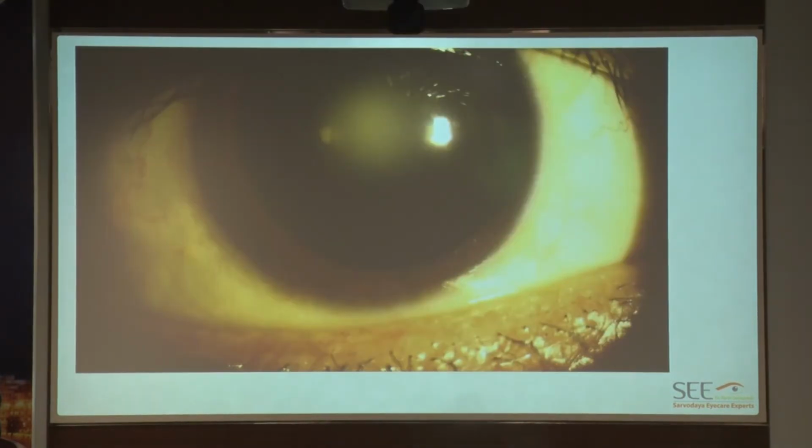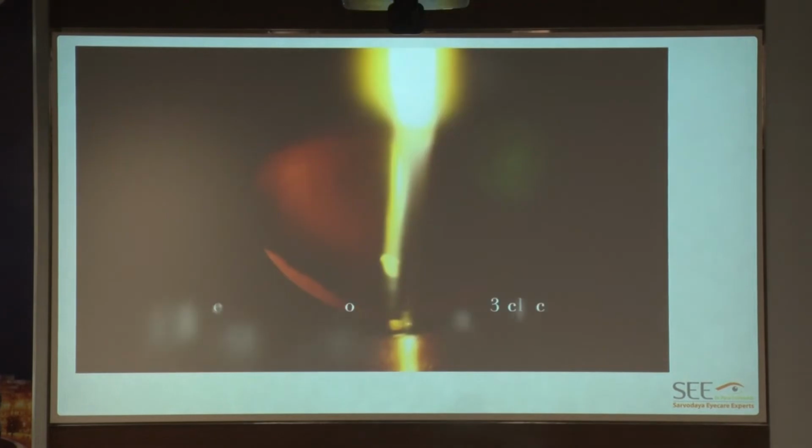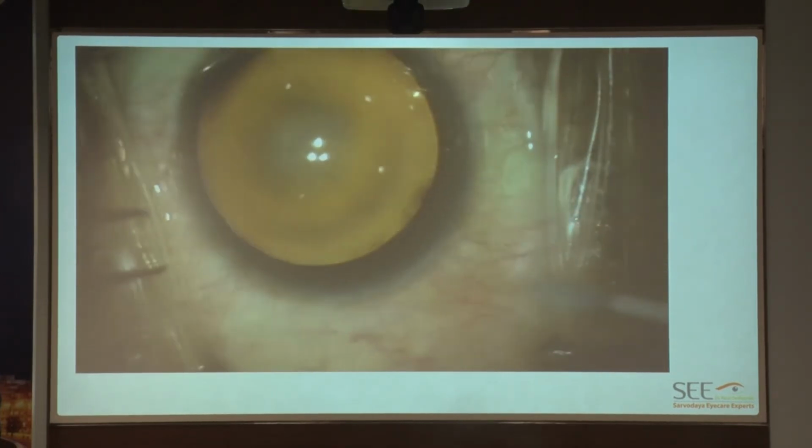So, this is one of the surgical videos. It was a young patient, post-traumatic, and he had zonular dialysis in two areas opposite to each other. They were about 2 or 3 clock hours each, on opposite meridians.